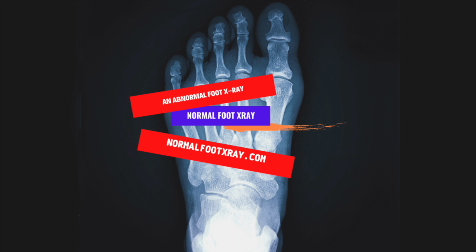An abnormal foot X-ray can also help determine the proper alignment of the bones and whether a patient is healing properly. During a surgical procedure, it can help the physician plan the surgery. It can also detect a tumor or cyst in the foot. It can be helpful to determine if a patient has an abnormal foot. If the foot is pronated or overpronated, an X-ray can help determine the cause and treatment.